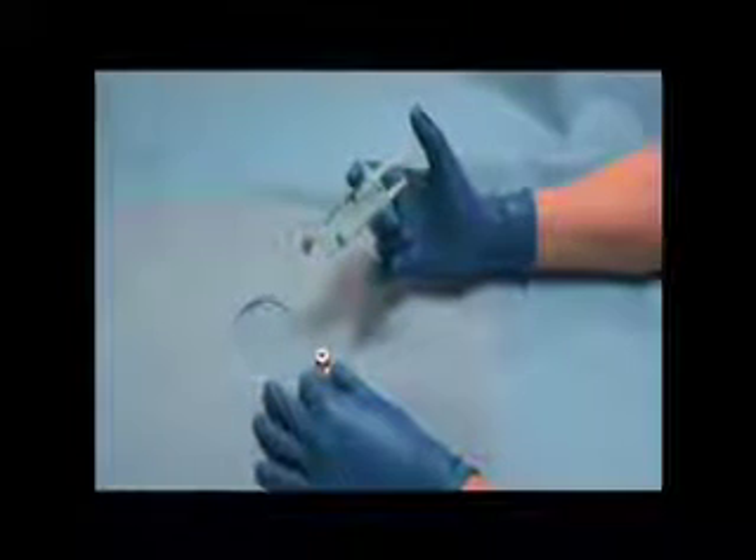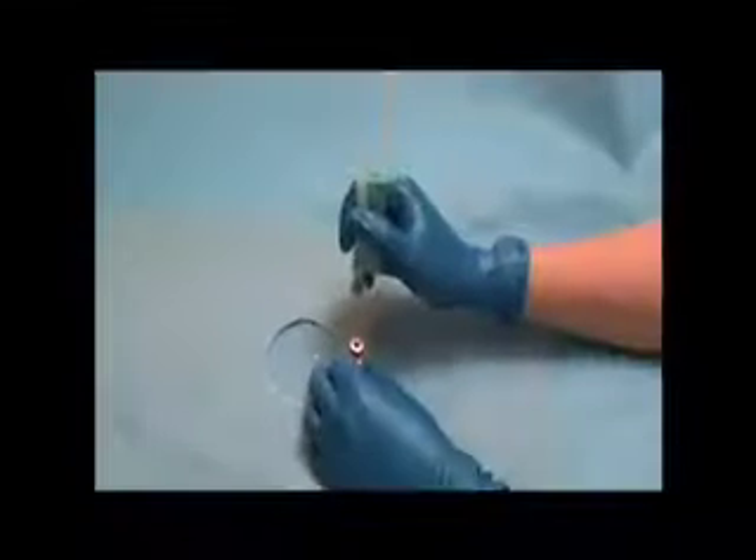Air bubbles are expelled by pressing on the injection plunger. When aspirating medications, the RPD can also be held in the pencil grip, with the other hand operating the plungers.